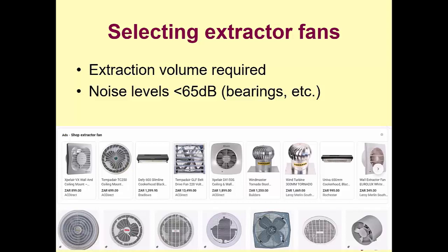One of the big problems that we find with extractor fans is fan noise, and even the bearing noise of the fans. And this can be very disturbing if you're busy with consultations and with patients and so on. So I normally say that I want a fan with proper bearings inside, so that the noise levels are less than 65 decibels. That's typically the cutoff that I want to have, which is a very, very quiet fan. And there's a few of them that have been installed in our hospital that are working very, very well.